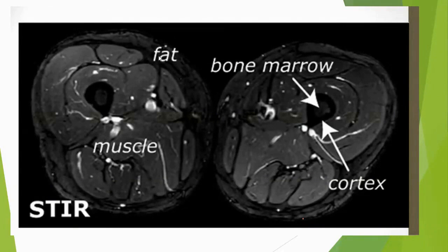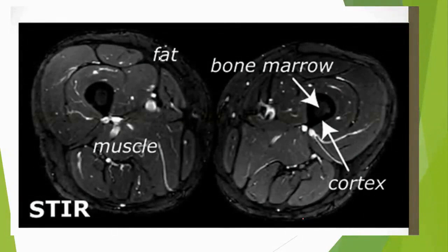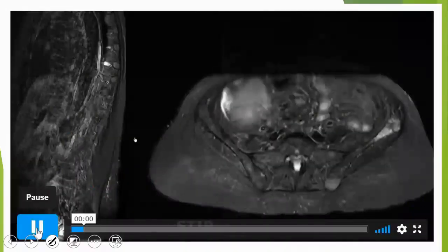We understand the method, and we understand the work. Let's create something based on the differences between the various tissues in our magnetic field properties. So, what does this mean? This image, if you look closely, shows the muscle and fat. In this image, if you pay attention, you can see the fat. And here is the muscle, which is darker than the areas that contain fluid. For example, in this image, you will find it clearer, perhaps even more so.